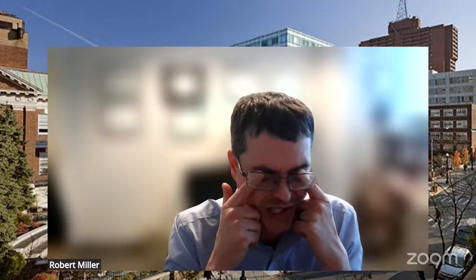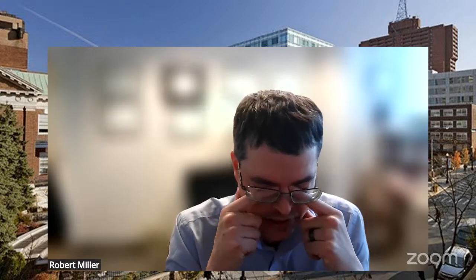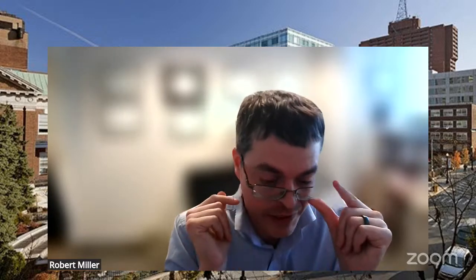Yeah, I think that's a great question. And I'm going to break it into 2 parts because I think there's an embedded question there, which is in terms of the diversity side of our AI models. So what I'll say is if you just train an AI model in an unselected cohort of patients, let's say for finding coronary disease, and you select patients who all went for cath, there's huge bias in that cohort.